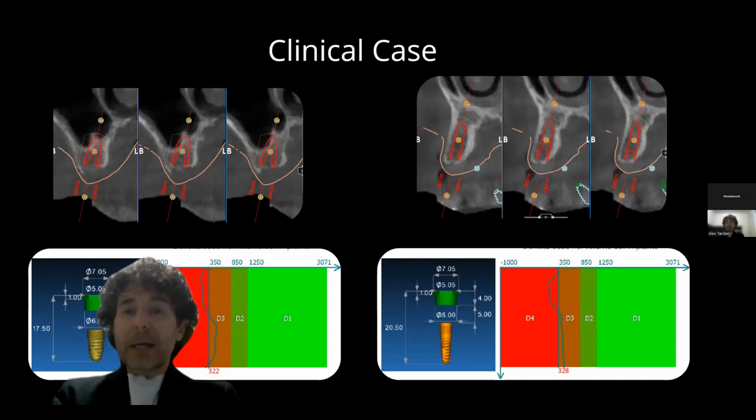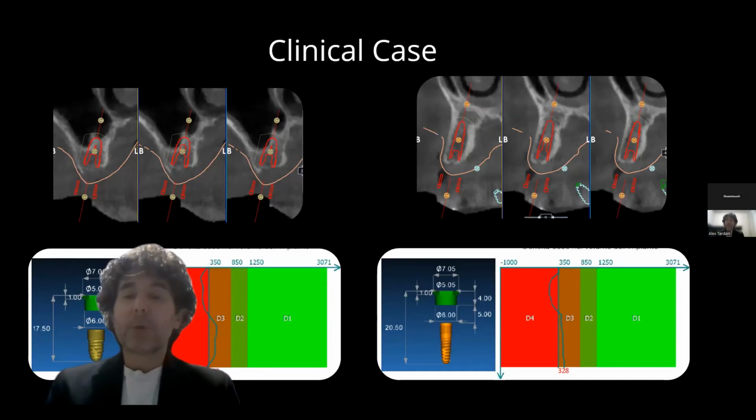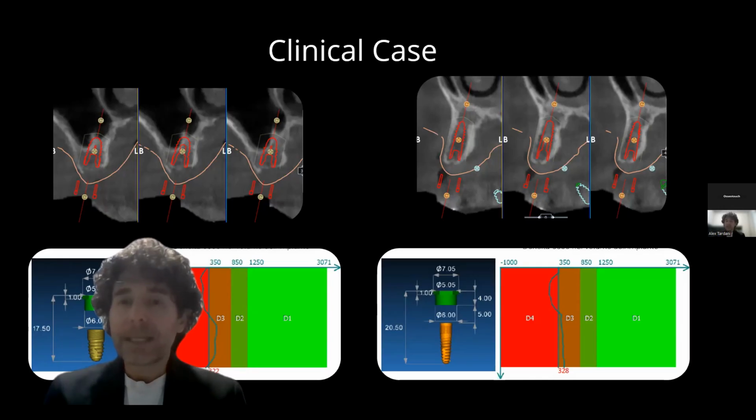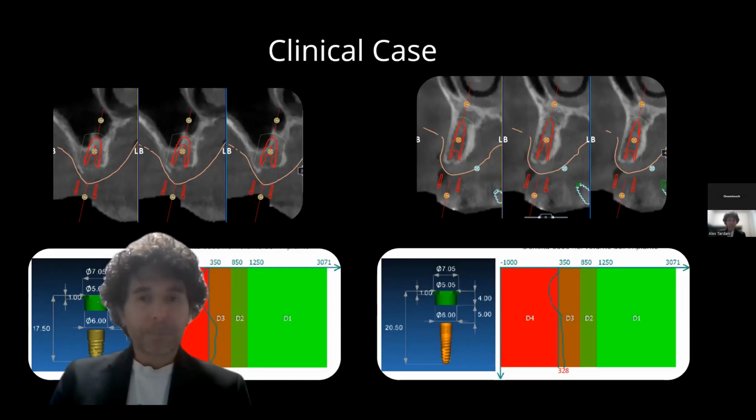So, in this case too, the use of a drill would have risked leaving a buccal cortical plate that was probably too thin, creating a risk of dehiscence on some threads. Using the mallet with a guide, therefore, without risking any deviation, allowed us to perform a minimal expansion of the buccal cortical plate and therefore certainly guarantee greater longevity for this implant over time.